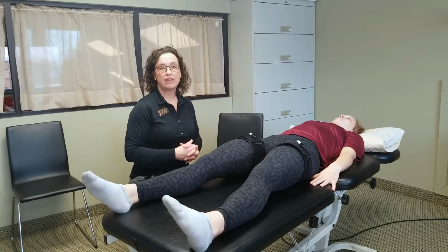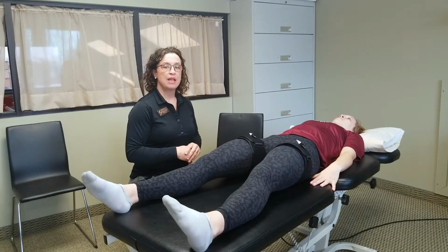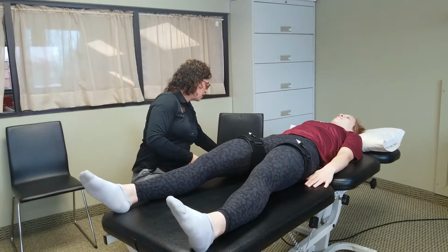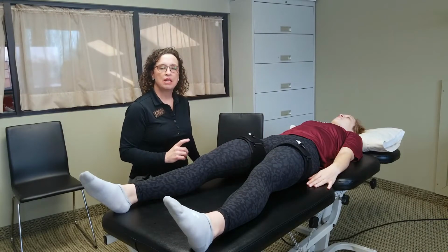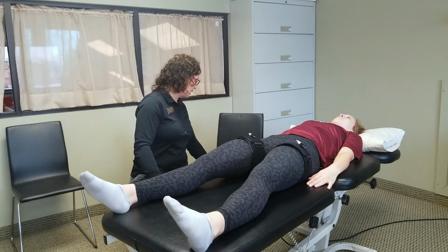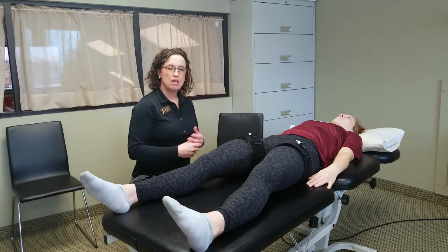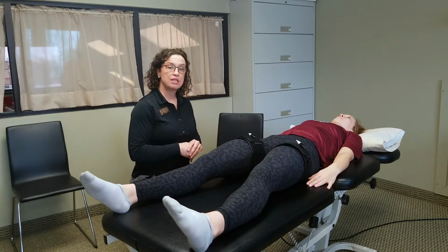Because maybe she's having some knee pain. Maybe she's having some back pain. Maybe she isn't able to work out right now. And this is a way that she can stay in shape. So when we look at the research, when we do blood flow restriction therapy with low intensity exercise, we have the capability to produce enough changes in the chemical makeup of the leg that it actually causes the increase in cross-sectional area.